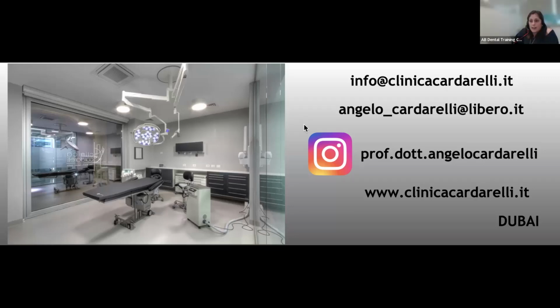How many implants will you place for full mouth rehabilitation? I will answer this question in the next webinar next week. But anyway, just to answer you, it depends. Sometimes the minimum we need to have is 4 implants. If you have more bone, we can place 6. So at least 4 implants up to 6 implants. It depends on the amount of bone that we have. But I will explain how we can treat the atrophic jaws using different numbers of implants in the upcoming webinar next week.